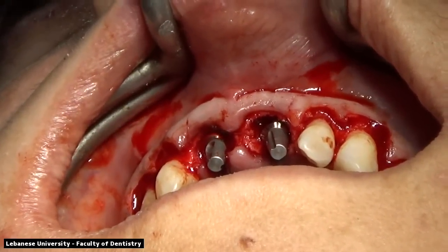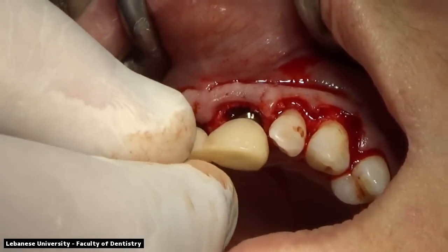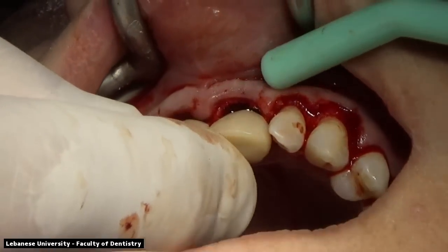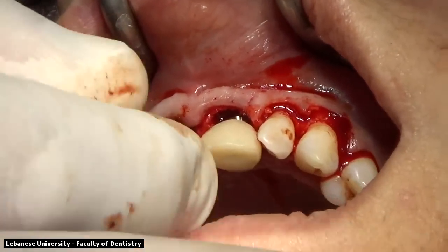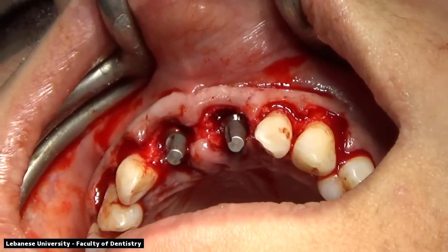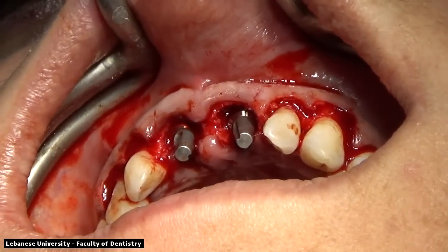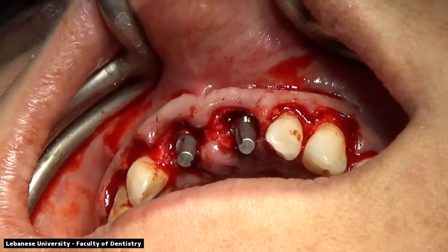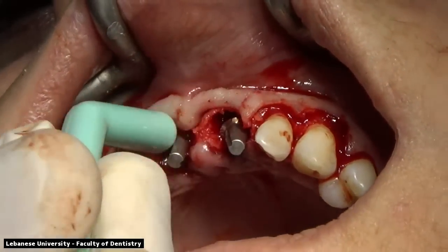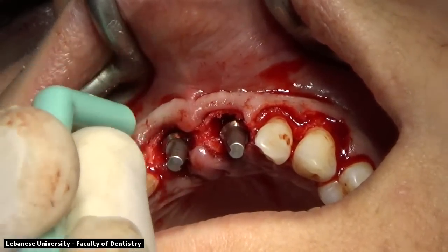I'd like to remind you that the temporary restorations have been prepared prior, and the inner surface has been relieved so that we can add some acrylic restoration material and reline those temporaries. It will be a fast reline because we already prepared them beforehand. After preparation of the temporary restorations, that's when we're going to add our bone graft material and suture the area.